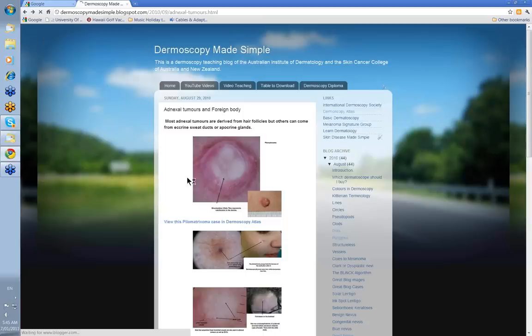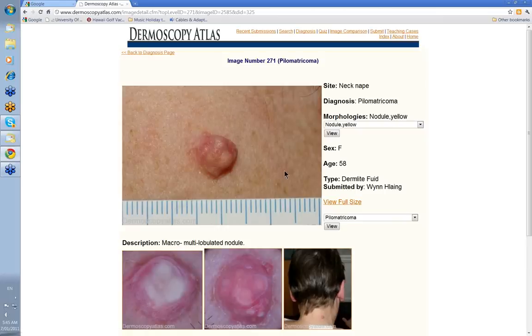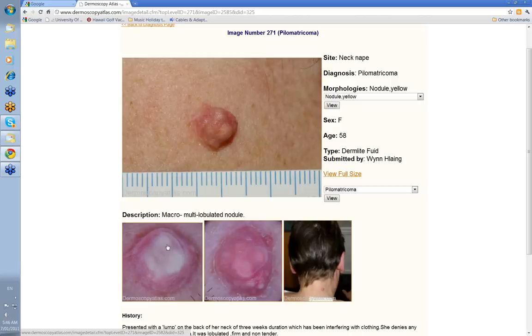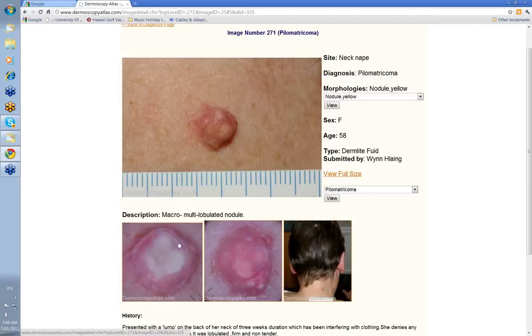This particular case we can have a look at in the Dermoscopy Atlas, submitted by Win Ling. Win shows this lesion on the back of the neck. This was how the lesion looked without much pressure. When you put pressure on it and obliterate the vascular component, you'll see the white calcification. You generally get calcification within these tumours — that's why they're firm and hard. The degree of whiteness you're going to see depends on the amount of calcification.